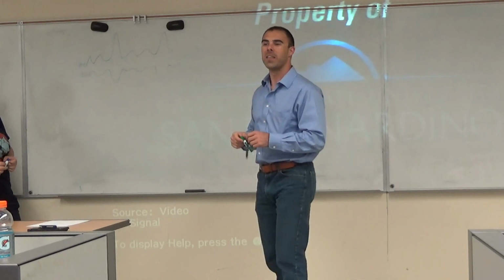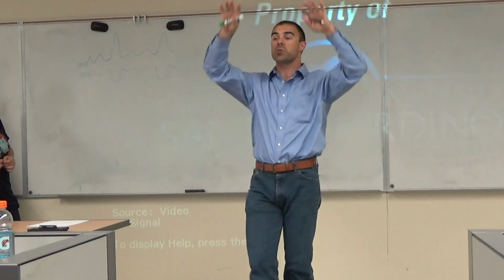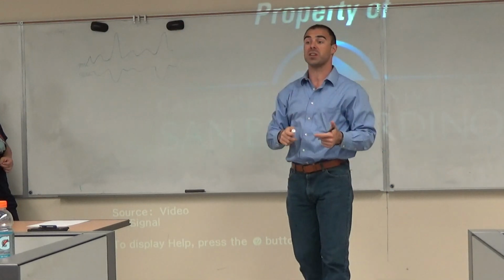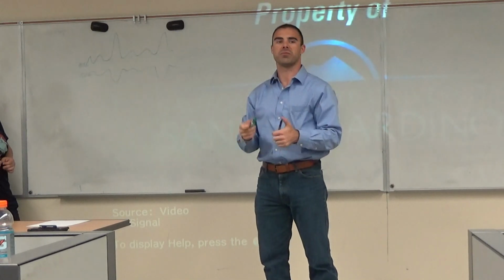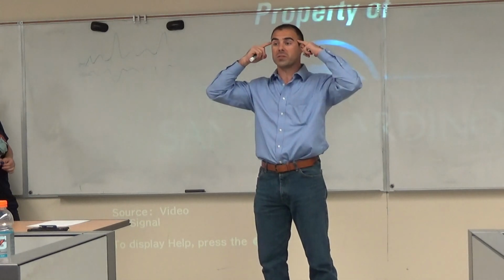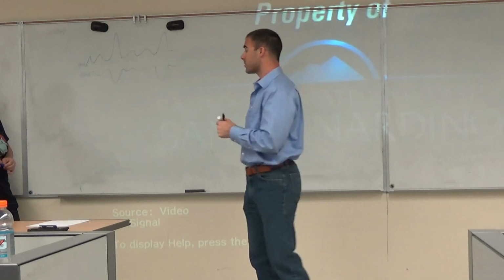What does VEOG mean? Actually, we did talk about it when we looked at those big screens of EEG going all the way across the screen. We said there are labels, and remember we talked about the 10-20 system? Then we asked what these bottom electrodes are where we can see the eye blinks. We said there were vertical electrooculograms, and then there are also the horizontal ones, remember? It's like the saccade over there? Yeah, exactly. Good job, Kelsey.